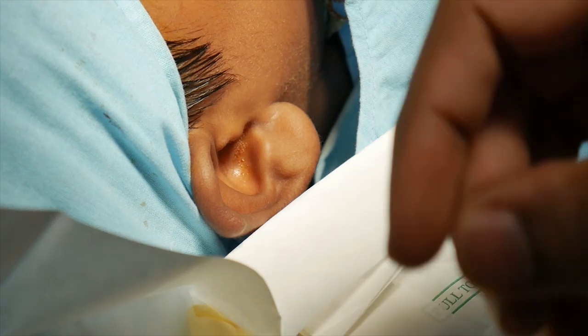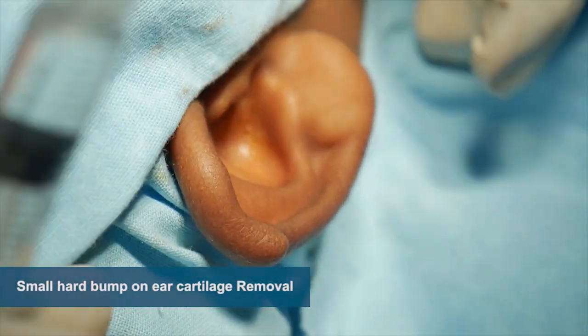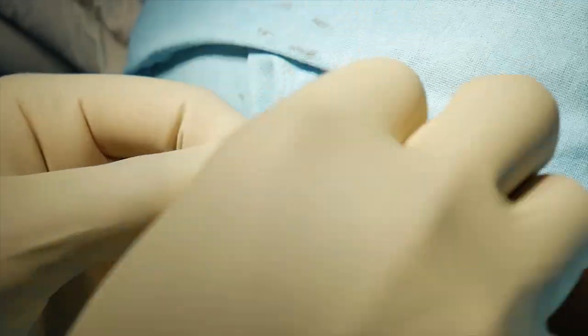This is going to be separate only, definitely. We are going to cover that face once again. Only the ears should be removed. Dry gauze.